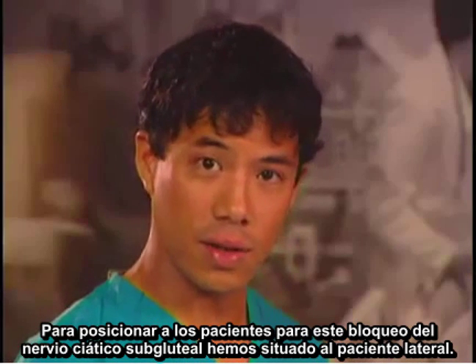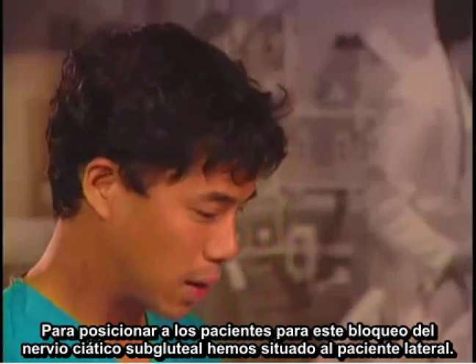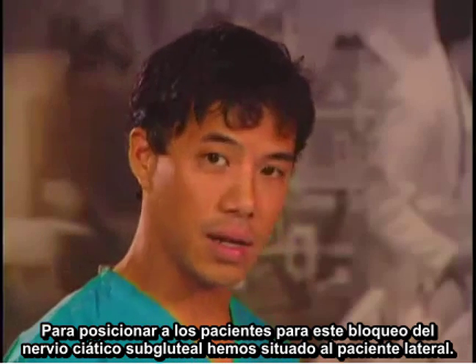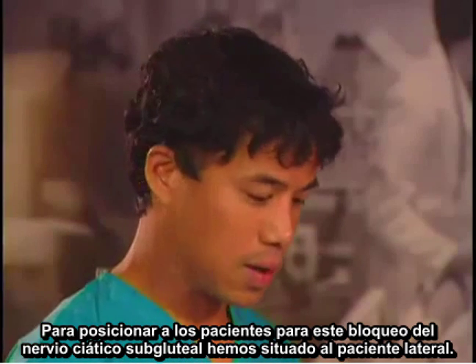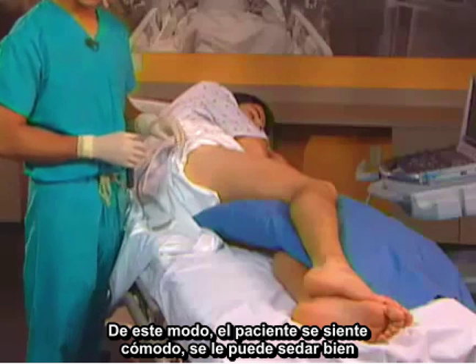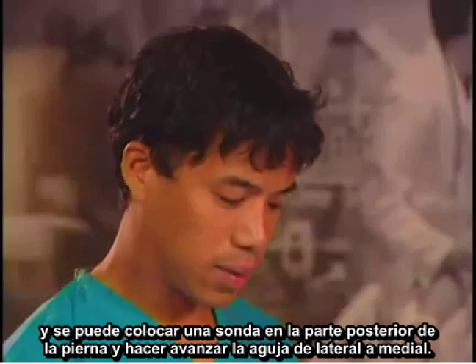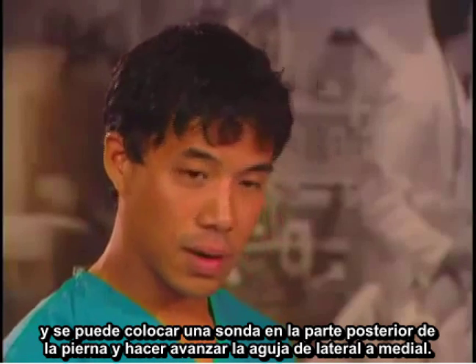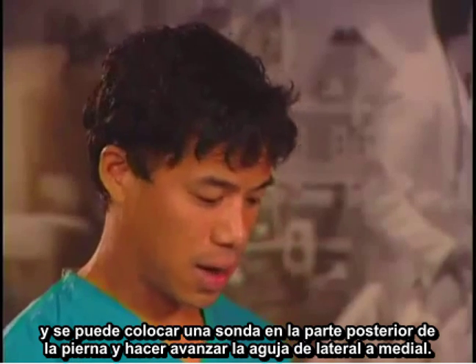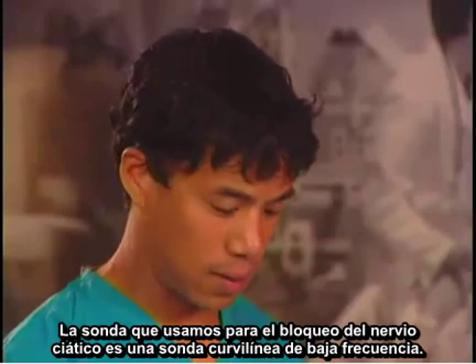To position patients for the subgluteal sciatic nerve block, we position the patient lateral. This way the patient is comfortable, they can be well sedated, and you can place the probe on the posterior side of the leg and advance the needle from lateral to medial.